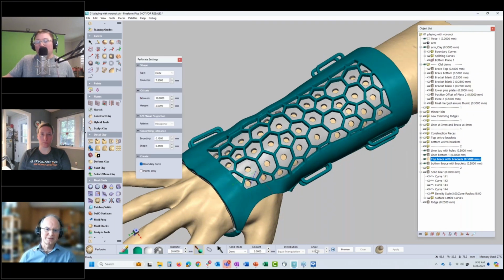Clinically relevant. I think that's the biggest thing, is that you guys are putting in features, obviously, that people request, but that are definitely clinically relevant, that are going to help outcomes. And I think this is going to be a really good additional feature to it. So I'm looking forward to getting my hands on this one.